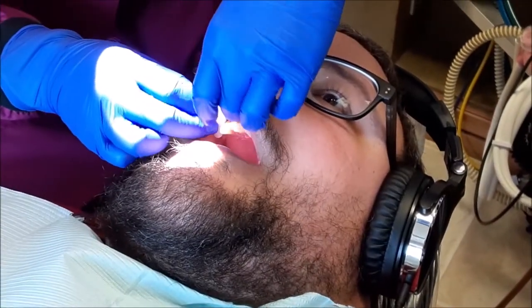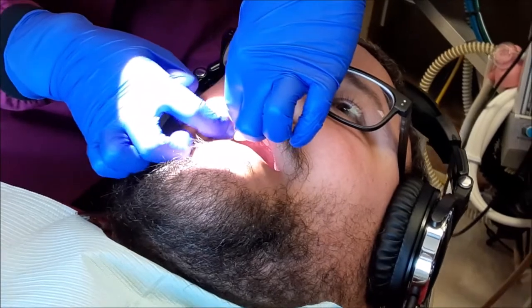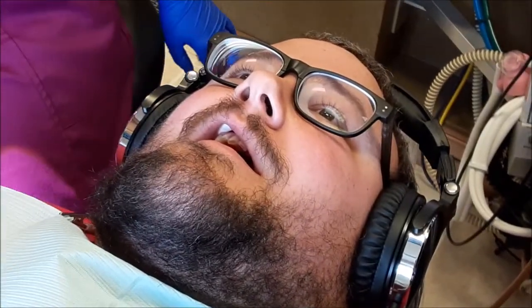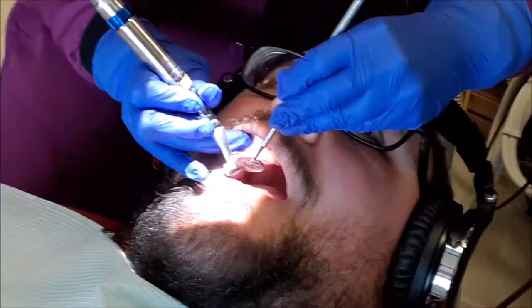Another rinse, or is that okay? I think that's okay. Good. Okay. Drilling up top here. So everything we're doing is very superficial. I basically just got to roughen the surface a little bit. So I don't anticipate you getting numb, but if anything's uncomfortable, let me know. Okay. Just gonna feel a little bumpy here.